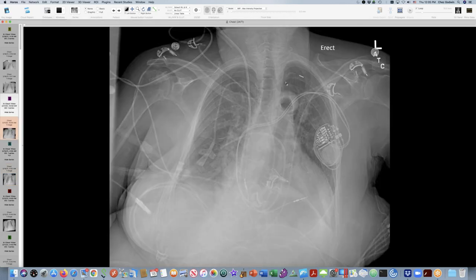You don't want to be damaging the subclavian artery with this balloon that wants to be more than a centimeter in diameter. The subclavian artery is going to have a hard time accommodating a centimeter balloon — this is going to damage the artery. So this is not a favorable location. If you just have this clip floating up here without gas in the balloon, it might be hard to recognize this as part of the intra-aortic balloon. This is actually the proximal marker on the balloon.